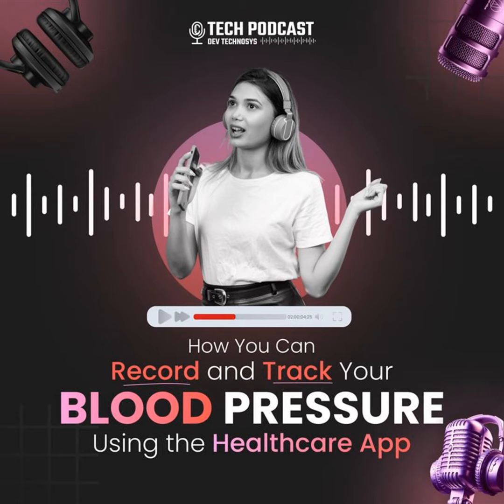And how do they record BP data? Is it manual or automatic? It can be both. If you have a digital BP monitor with Bluetooth, many apps allow integration. The data syncs automatically. But even if you're using a regular home BP monitor, you can manually enter readings: systolic, diastolic, and pulse rate. Most apps let you add the time and any notes, like whether you were resting, stressed, or after exercise.